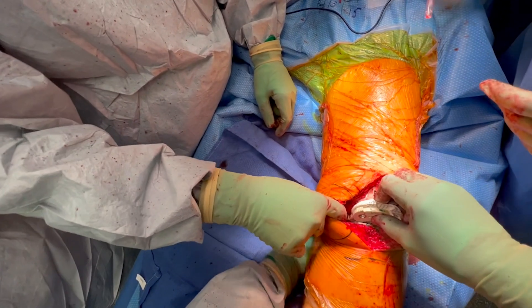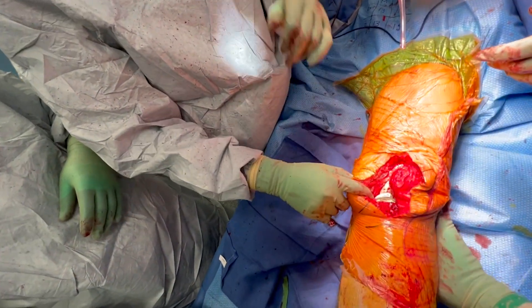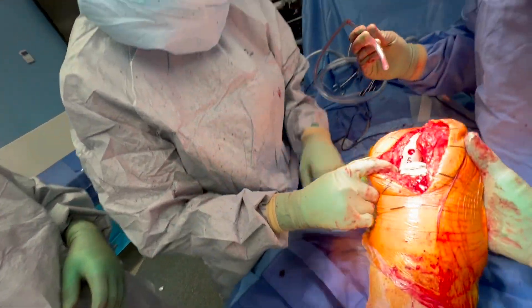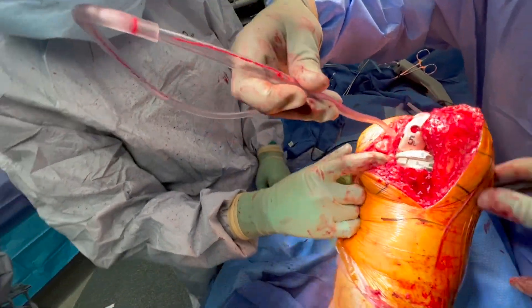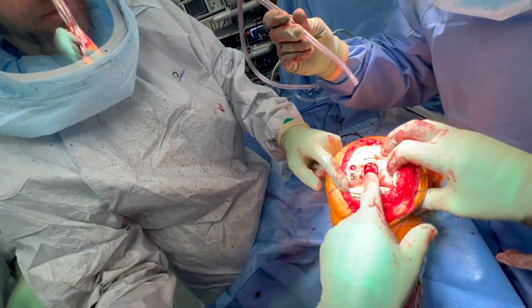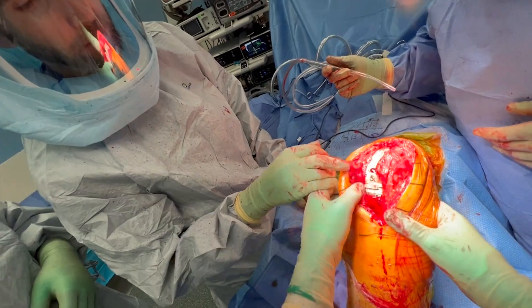I go ahead and trial. Place our trial insert, and you can see the knee comes out into full extension very nicely — it looks really nicely balanced and it felt great. I'm saving the PCL in this case and the PCL tension felt good. I do like to use the medial stabilized type inserts — there's more congruity on that medial side and I think it's kinematically more normal for the knee. So I'm using one of those MS type inserts here. Then we go ahead and close the knee.